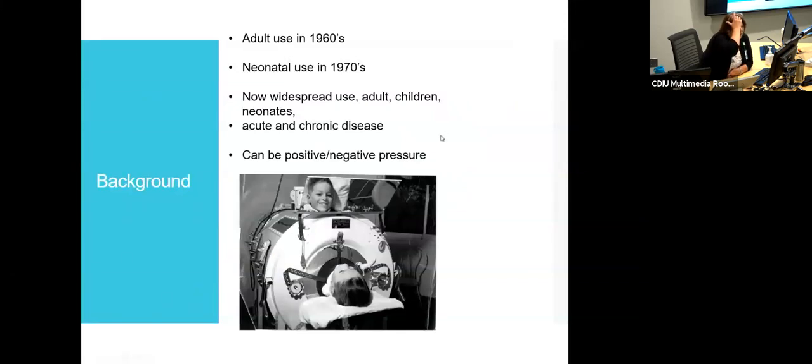So there is, like a lot of things in pediatrics, a paucity of information about non-invasive use. It has commonly been used with adults, and it goes back as far as when we started ventilating fairly regularly back with the polio epidemic.